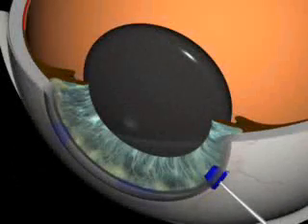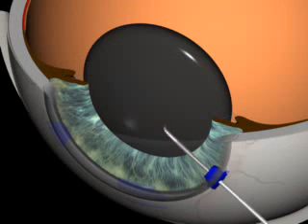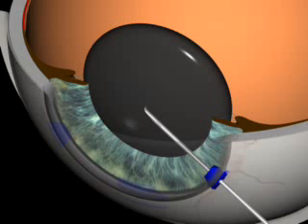Capsulorhexis. The anterior capsule is opened with a bent needle which is inserted through one incision. Capsulorhexis starts with a central puncture followed by a radial cut.